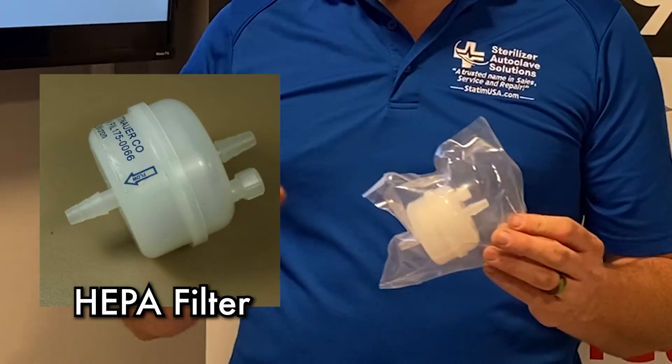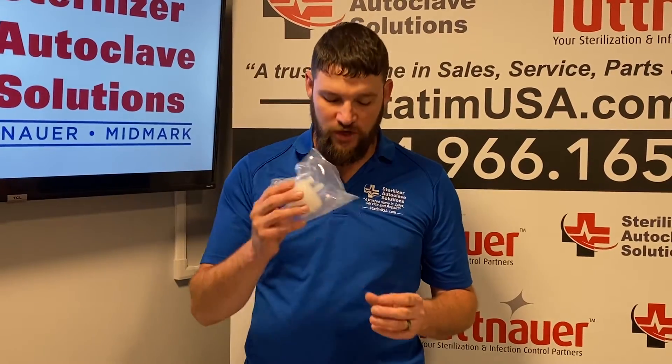A HEPA filter. Your HEPA filter filters the air from outside that is going into your chamber during drying.